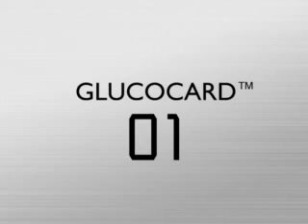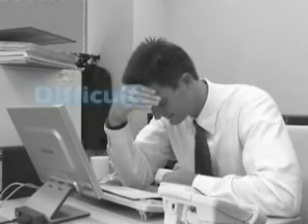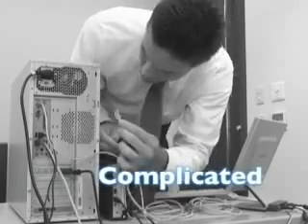Glucocard 01. Difficult? And complicated? Not at all.